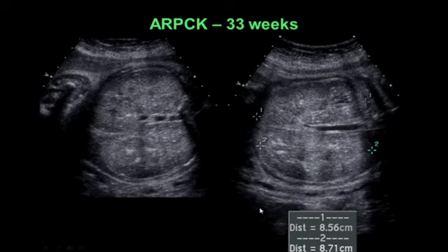So here's a fetus at 33 weeks gestation. Notice on the two images that there is no amniotic fluid. Very severe oligohydramnios is present. The kidneys are enormous. They fill the fetal abdomen.